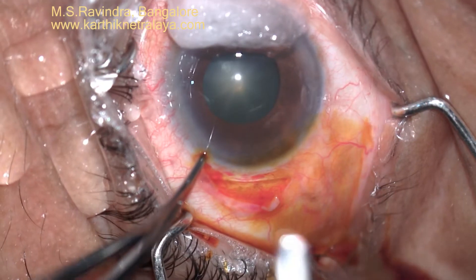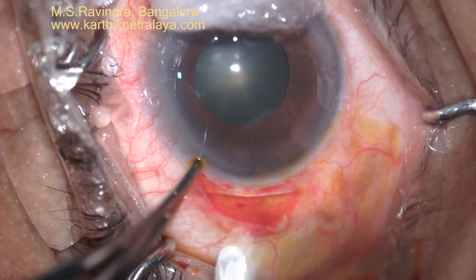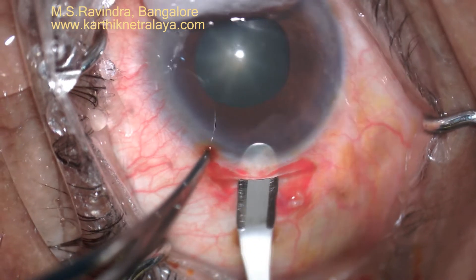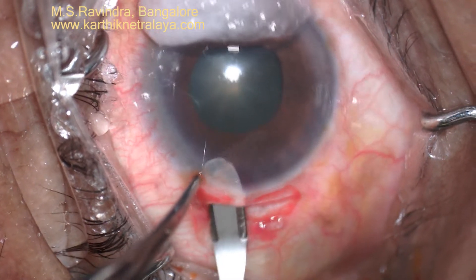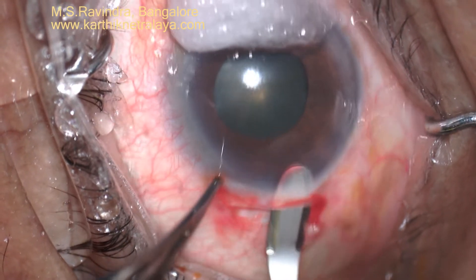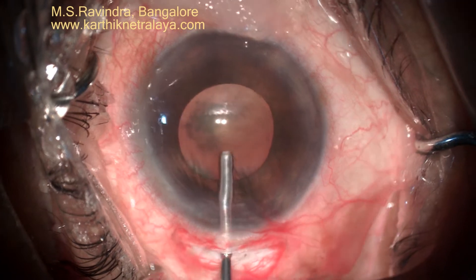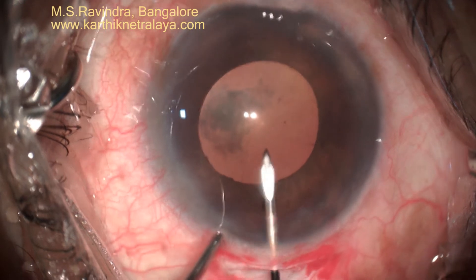A tunnel is created and hemostasis is achieved. A six millimeter by about 2.5 millimeter sclero-limbal corneal tunnel is prepared in the upper temporal quadrant of the right eye. The plan is to do the tunnel floor entry so that a small incision is made in the internal opening of the tunnel.